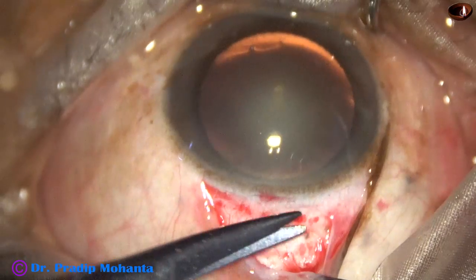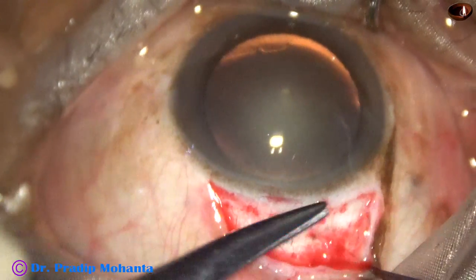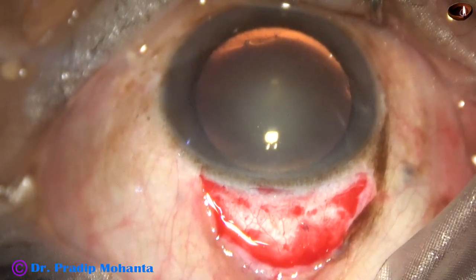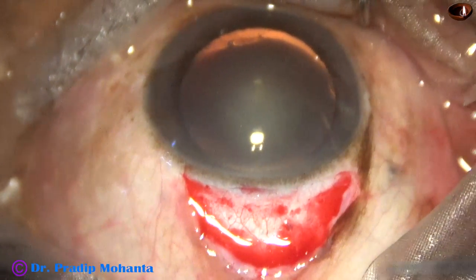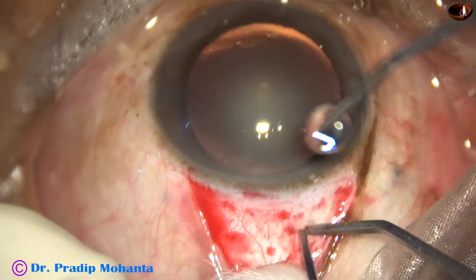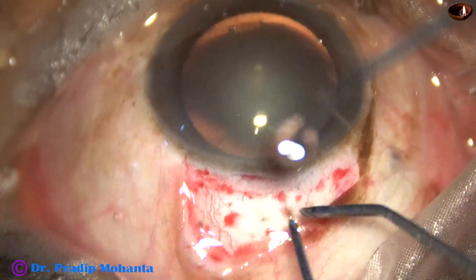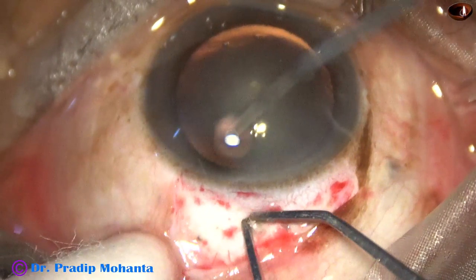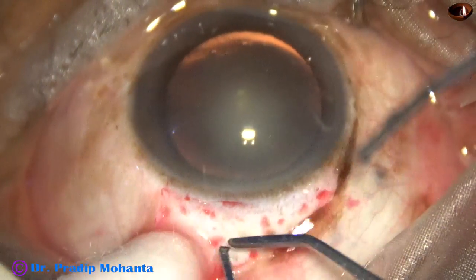This is Tenon's capsule. It is being dissected from the sclera. The sclera should be exposed — we must not apply cautery over the Tenon's. Expose the sclera and just touch over the blood vessels and do very mild cautery. And it is done.